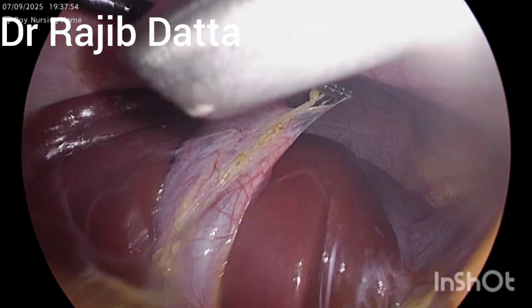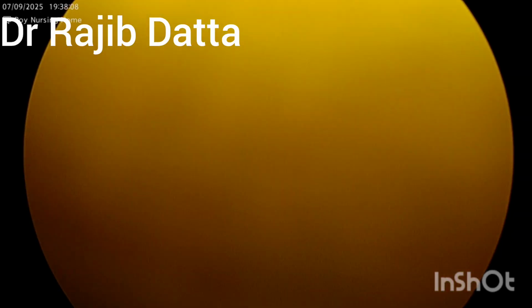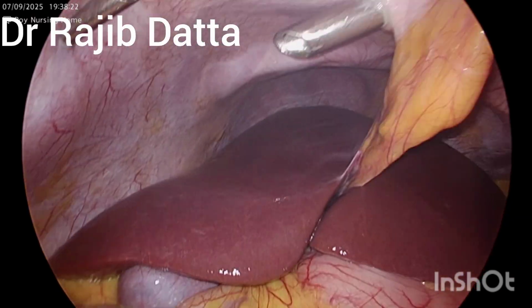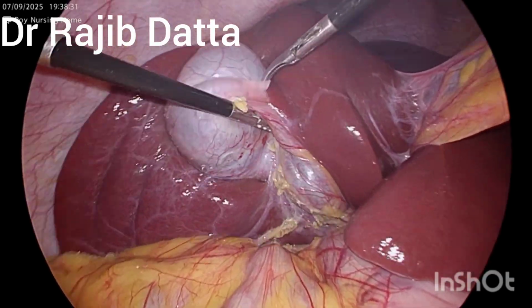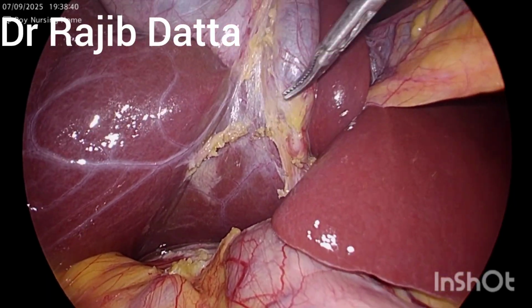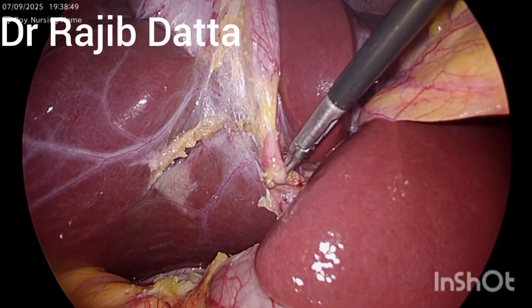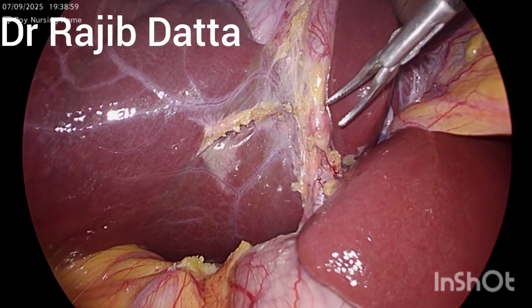Now we are again retracting the gallbladder towards the ipsilateral shoulder, and each and every movement should be precise enough so that no lateral thermal damage occurs. And with the help of this Maryland forceps, we are trying to create a room in between the liver bed and the cystic pedicle.